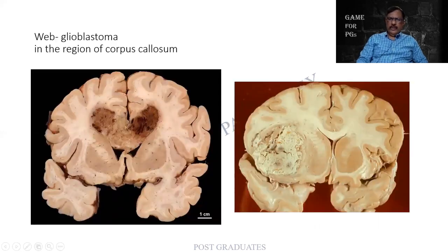Tumors as such. Tumors, sometimes you are lucky, but we do not know the extent of the tumor. This is the case of a glioblastoma. It is rather kind of diffuse. Usually it is said that a tumor doesn't cross the midline. In this case, it crosses or rather pushes, and then I'm able to find a lesion over here. This also, it is well circumscribed.